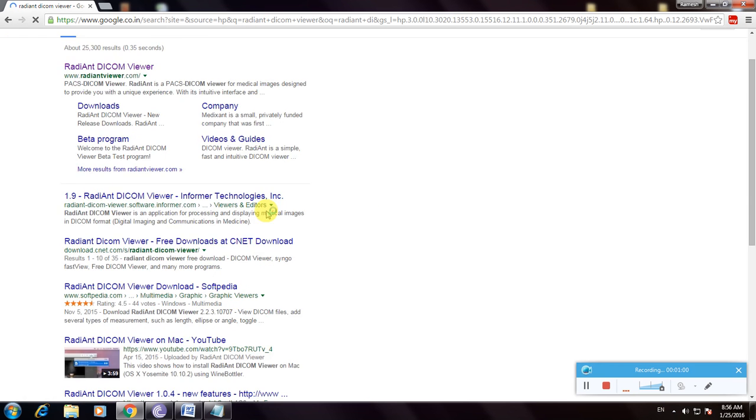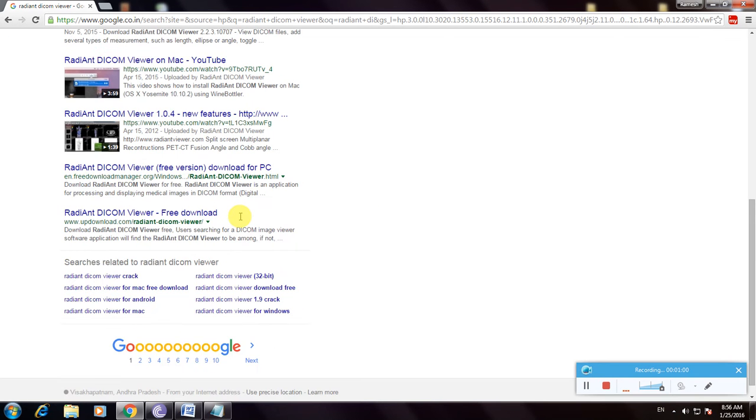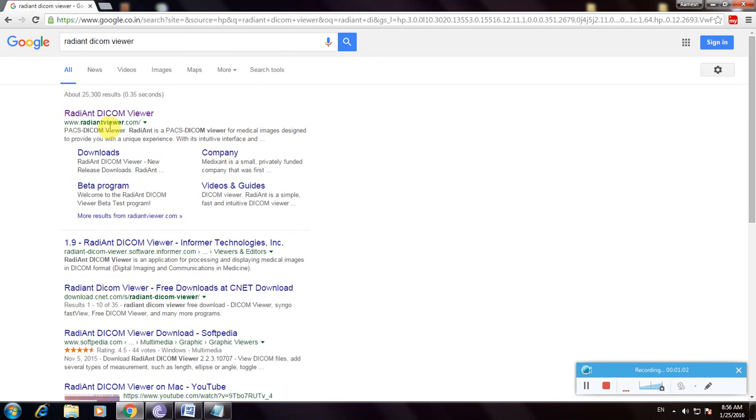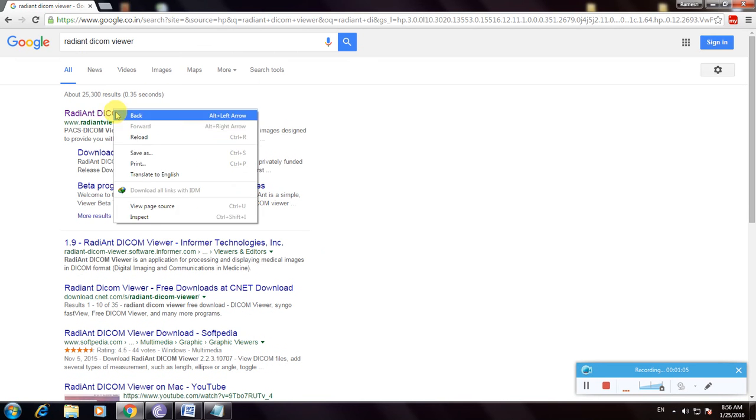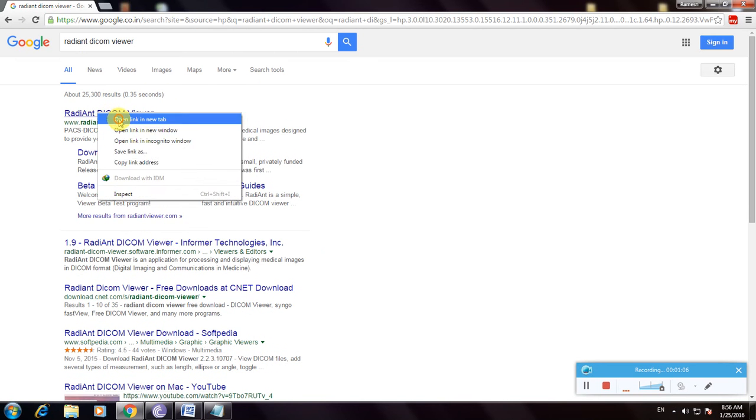Many links appear. The first link is the main website, that is the RadiAnt viewer. So click here to open.